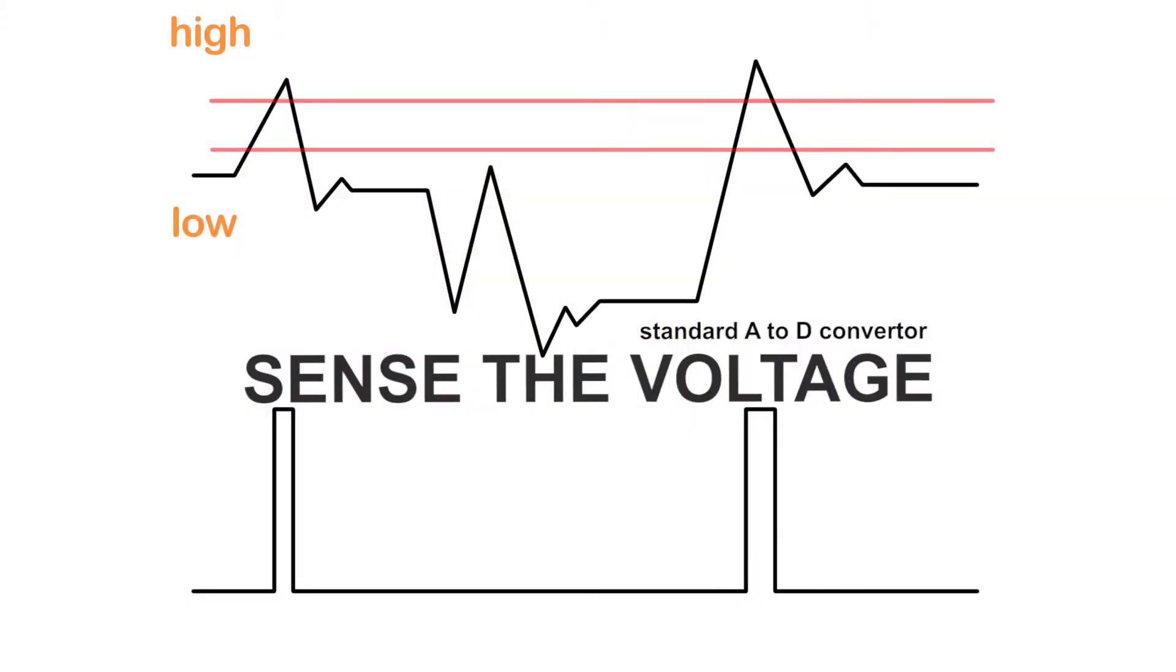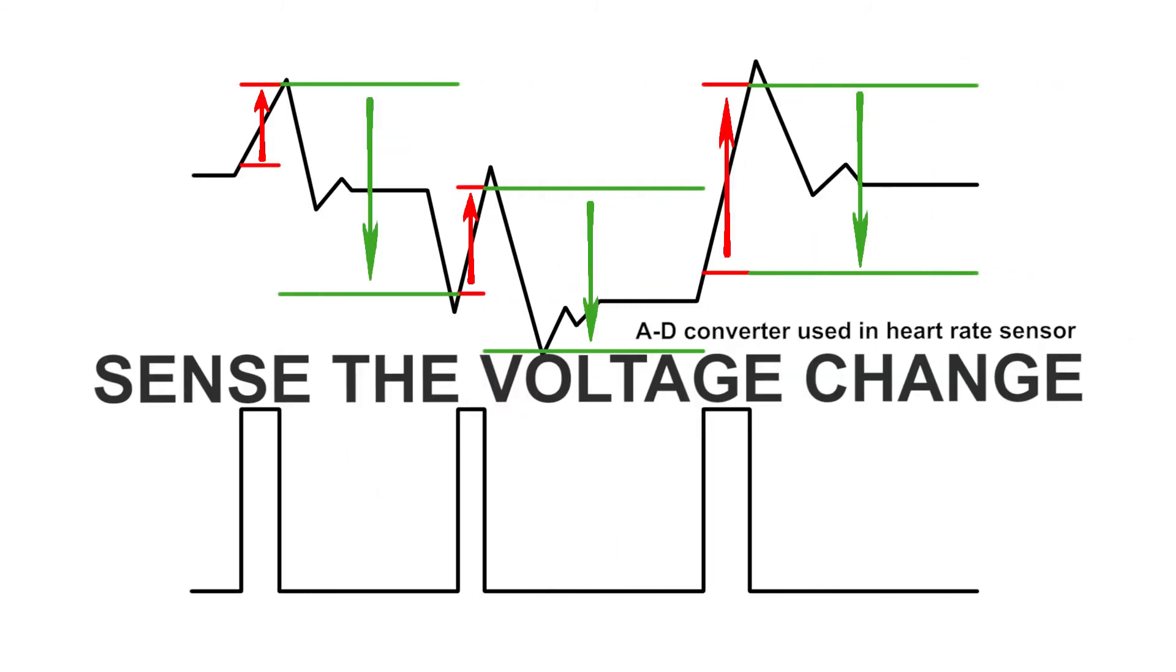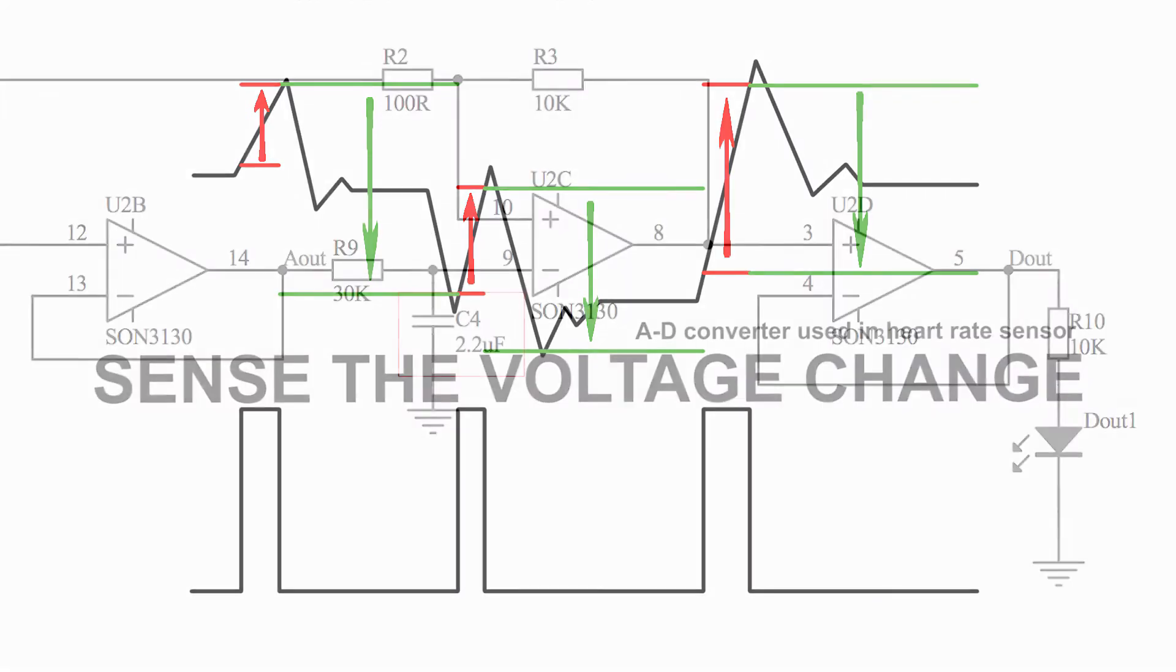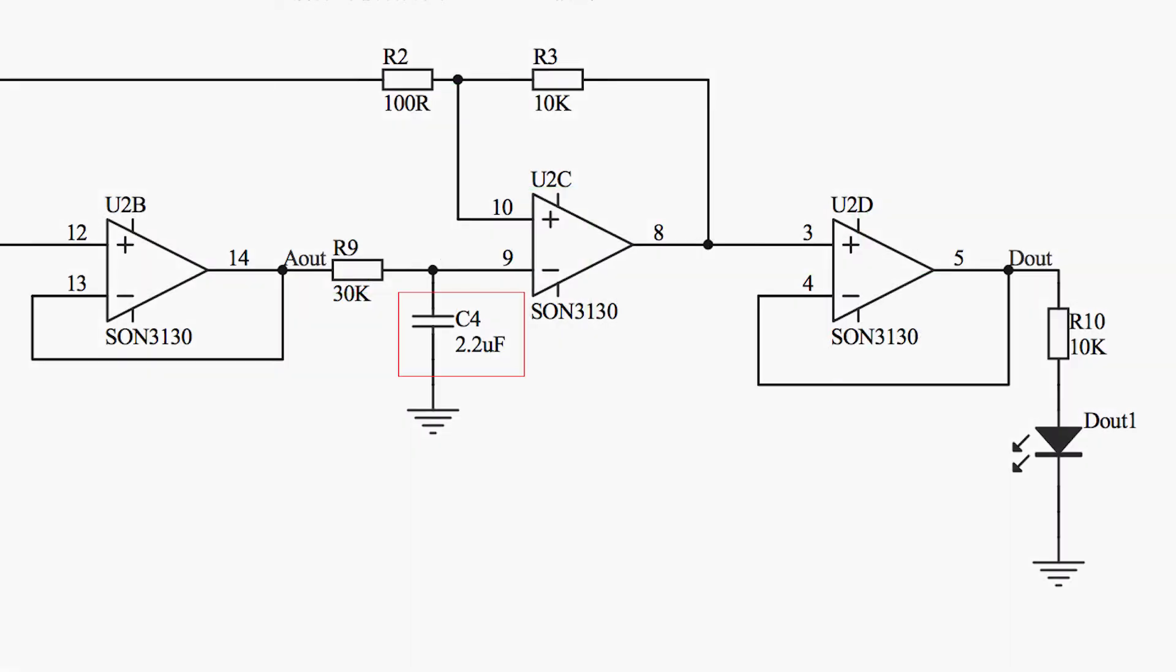To achieve this, a standard A-to-D converter is not enough, since the average voltage shifts throughout the time. Therefore, we need the A-to-D converter to sense the voltage change instead of the voltage itself. The following circuit is used to compare the voltage difference of the same analog signal but between short intervals, which tells us whether the voltage is going high or low.